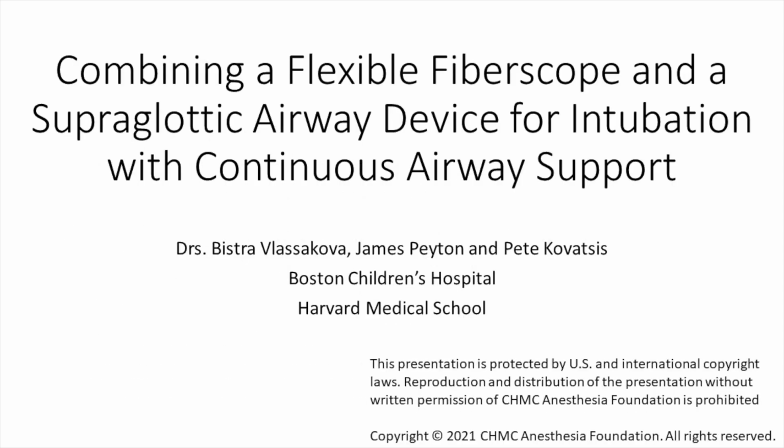We hope that this has provided added insight and guidance on the combination technique of a flexible fibroscopic intubation via a supraglottic airway. Thank you.